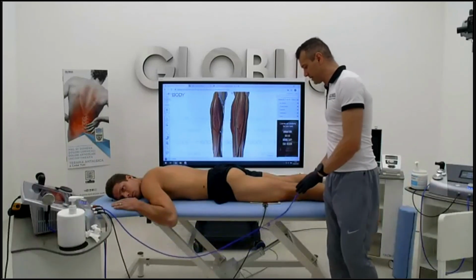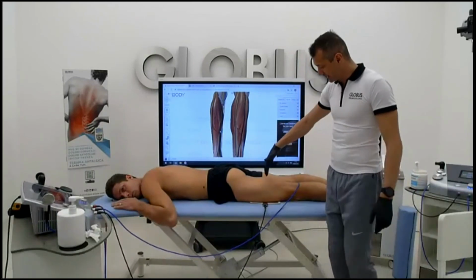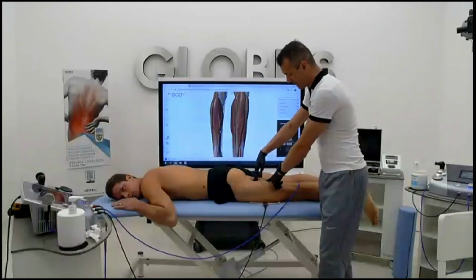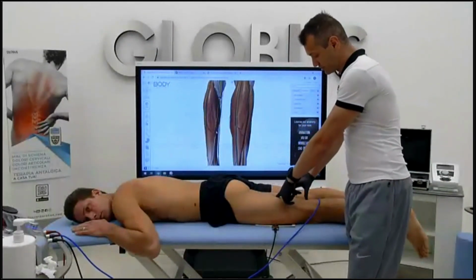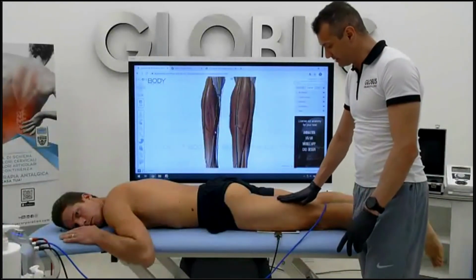Of course, if we are in the acute phase, maybe we are not going to use the tools directly on the lesion. But if I have the lesion here in the middle, in the medial third of the hamstring, I can have a stronger technique just above and a stronger technique just under. So for example, I just put an athermic treatment here.